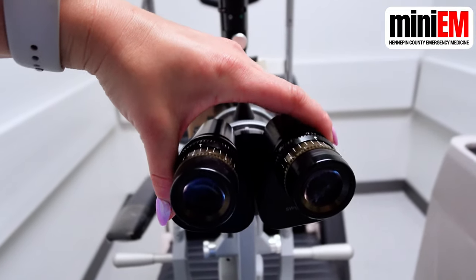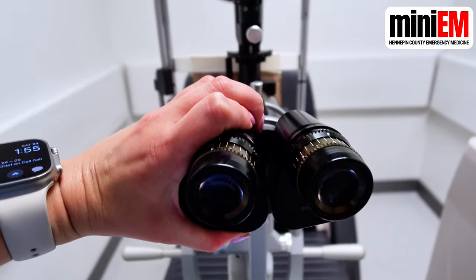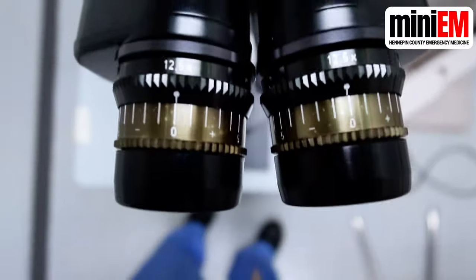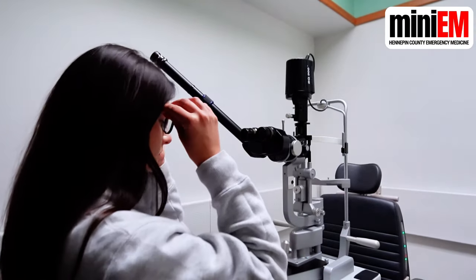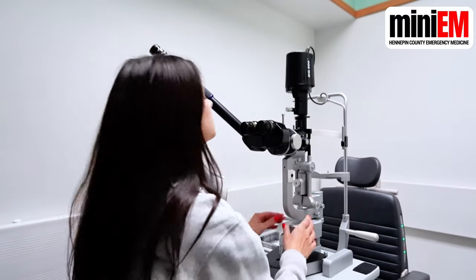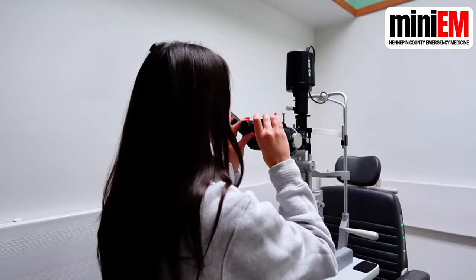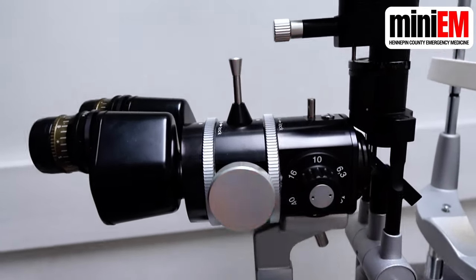Pull the eyepieces close together and then slowly pull them apart until you see one image with both of your eyes open. Set the eyepiece focus to zero, even if you're currently wearing contacts or glasses. The only time you need to change this is if you're wearing glasses and want to take them off — set the focus to whatever your glasses prescription is. Set the magnification to 10 times to start; you can increase this later as needed.